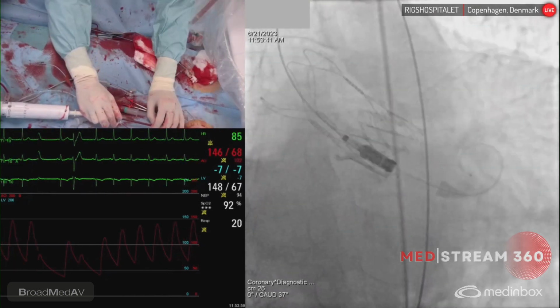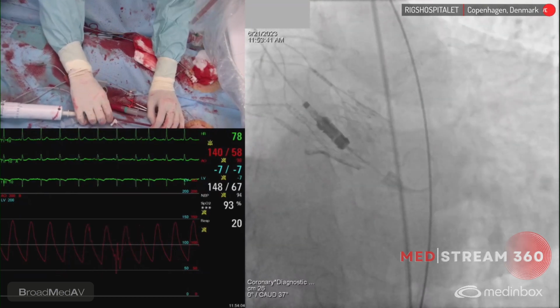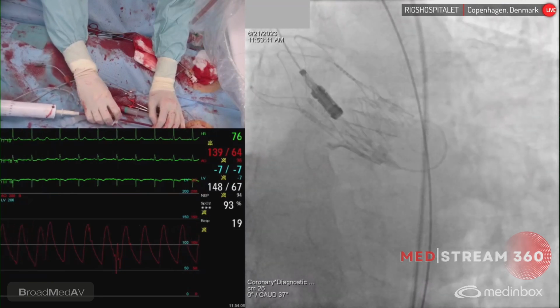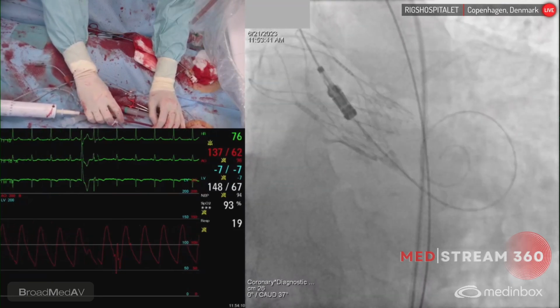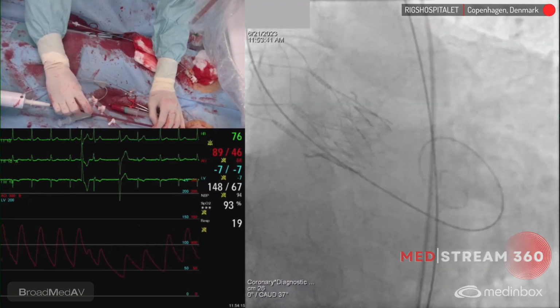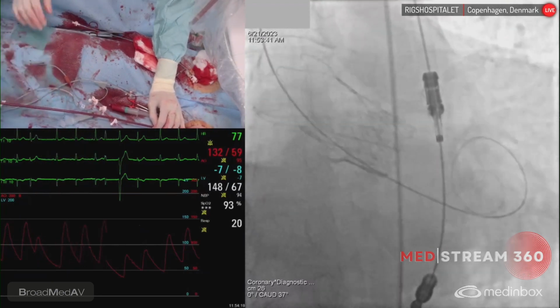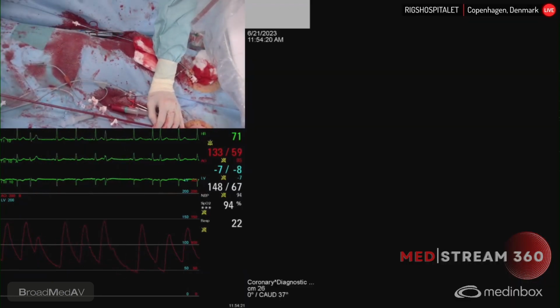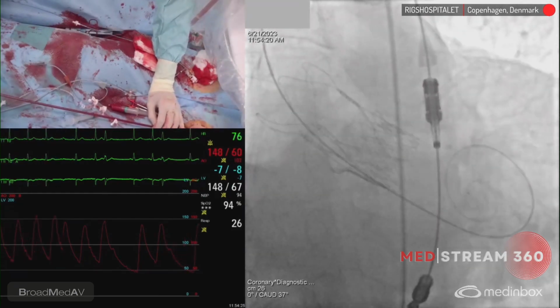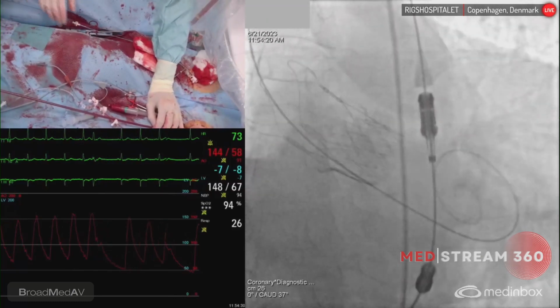Do not come out with the wire. Wait. Okay, come out with the wire, please. More. Yeah, all right, that's good. All right, that's fine. Okay, it was interesting to show how you can save this and how you have to do it. Now, number 2. That's the way to do it. But it's not for rookies, I would say.